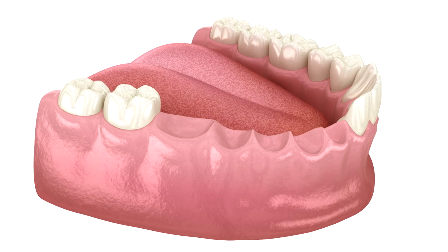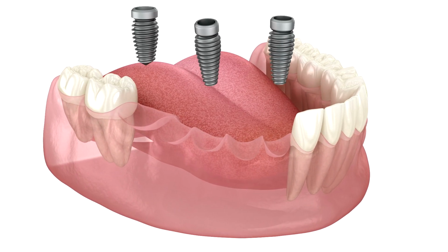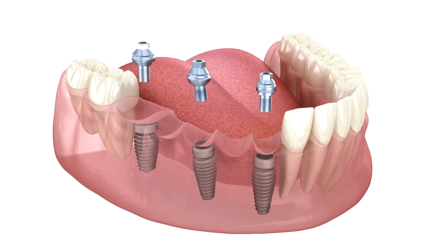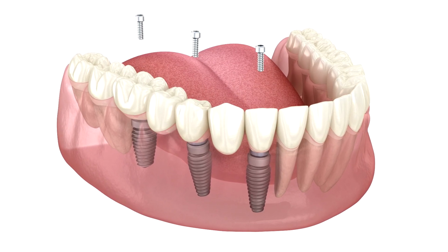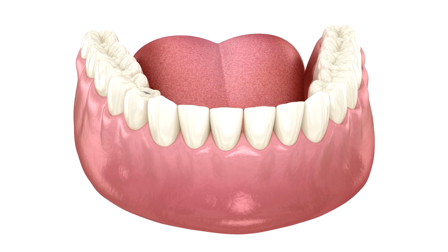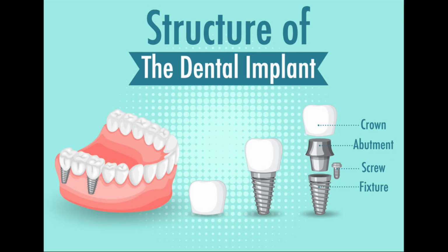Furthermore, the implant neck design plays a crucial role in managing crestal bone loss. Some implants feature microthreads on the neck to better distribute stress in the cortical bone, while others use a smooth, polished neck, relying on soft tissue attachment. The choice here reflects different philosophies on how to manage the biological width and prevent the dreaded saucerization, or horizontal bone loss.